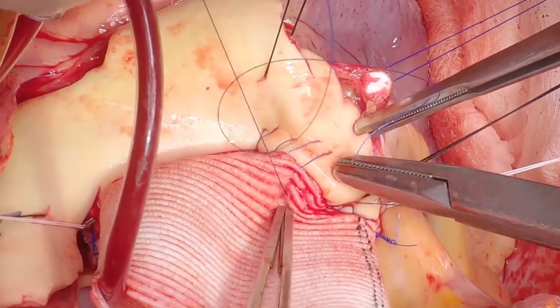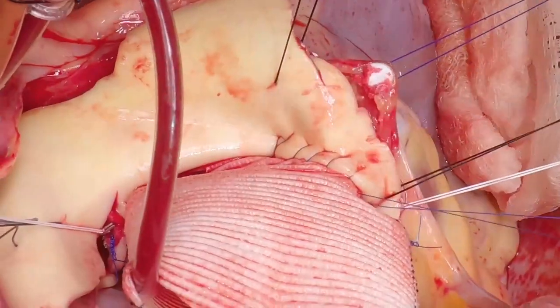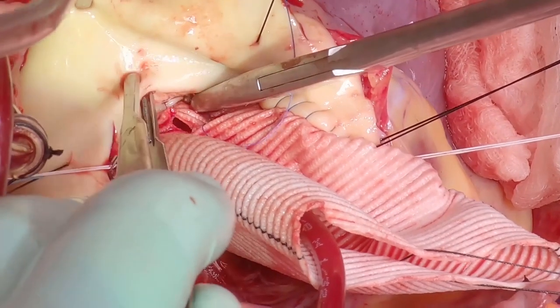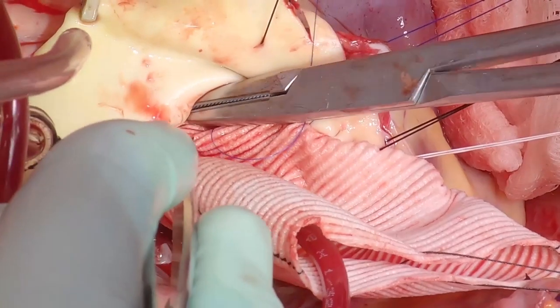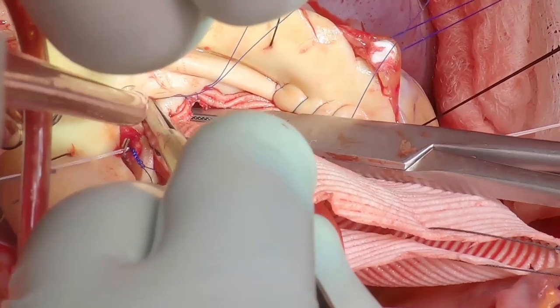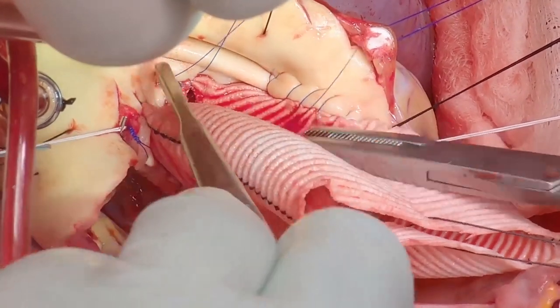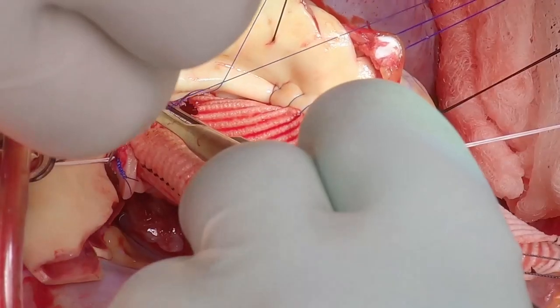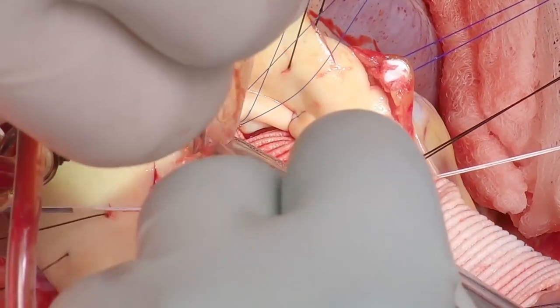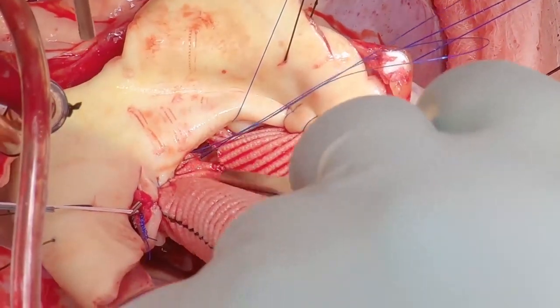Once the posterior wall is done, move around to complete the anterior part of the button. Complete the inclusion technique — I'm not generally a fan of the inclusion type of anastomosis, but I do use it for these remodelings and for homografts. The principle is to put your upstream suture first, then come into the ostium outside-in, posterior wall first. There's some overlap again with the annular suture line there, just to strengthen it.